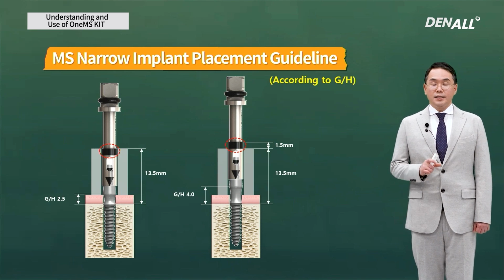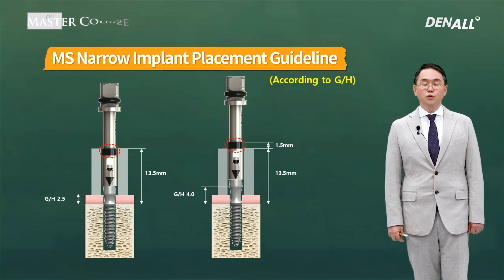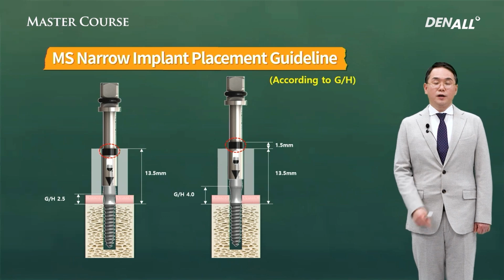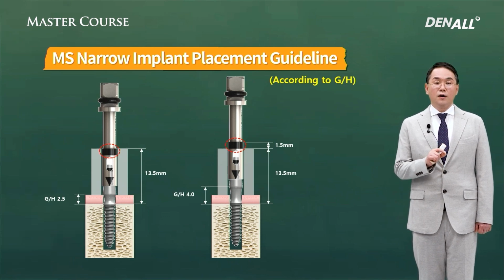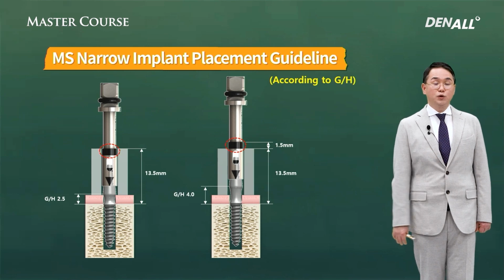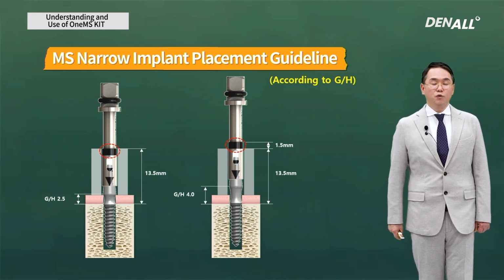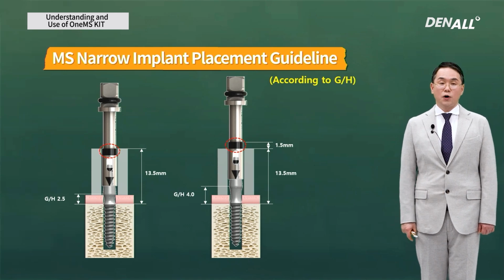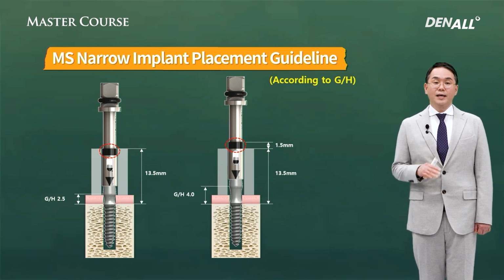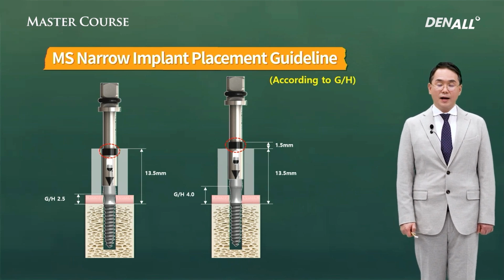The MS implants are divided into two groups depending on the gingiva height: gingiva height 2.5 millimeters and 4.0 millimeters. So when we place an MS implant, using the fixture driver to control the depth, if the gingiva height is 2.5 millimeters, the reference point is the black laser marking, up to the top of that marking. So the top part of that thick black laser mark should be the reference in terms of the depth of placement. For gingiva height of 4.0, the MS implant should be placed up to the bottom line of that thick marking. That is how to control the depth of placement.